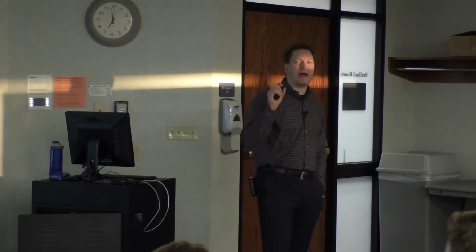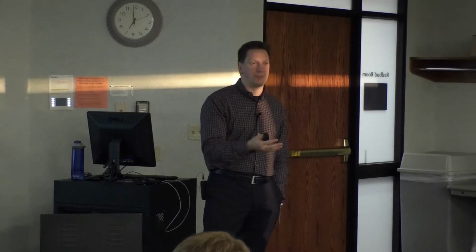You are allowed to have a small amount of left axis deviation, up to negative 30 degrees, but the lead 1, lead 2 criteria I just gave you takes that into account, okay? So if lead 1 and lead 2 are normal, you're done. Call it a normal axis and move on, okay? That means that the axis is somewhere between negative 30 and plus 90 degrees. Okay? When I say positive, what I mean is that both of those two are more positive than negative. You can have some negative component just as long as you have more positive. Everybody with me on that?